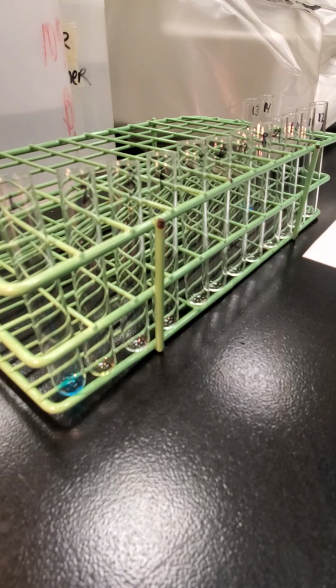And as you can see, I'm adding the more clear reagents to the tubes first, because once you add your red cells, it's hard to tell what you've added and what you haven't added, what still needs to be done. So by doing this, I know exactly where I am in the process. So if I get interrupted, I know where to pick up.